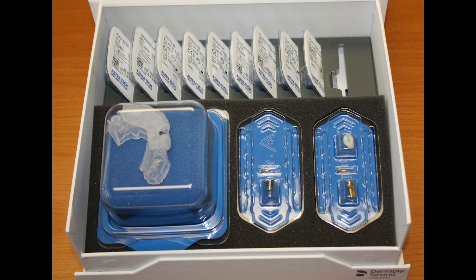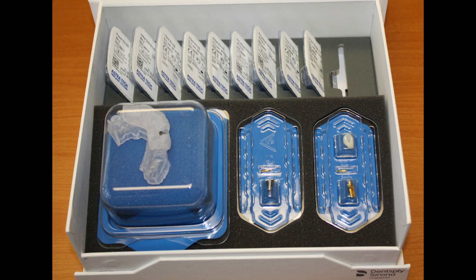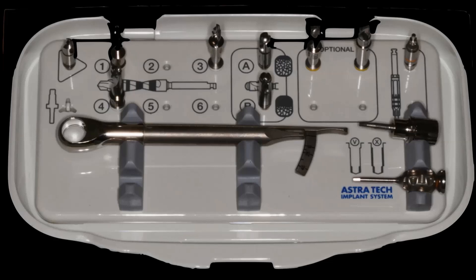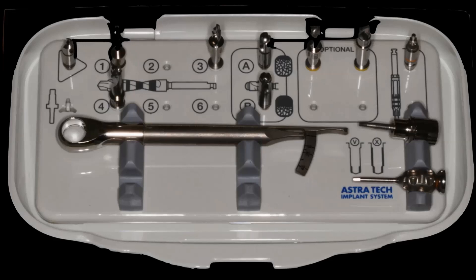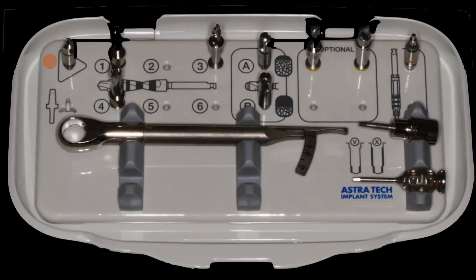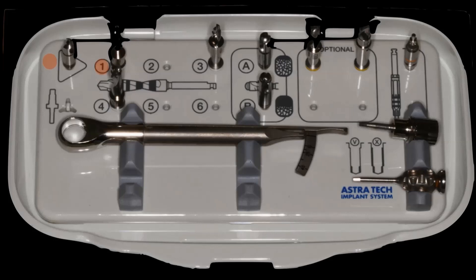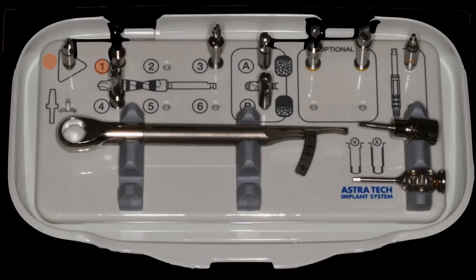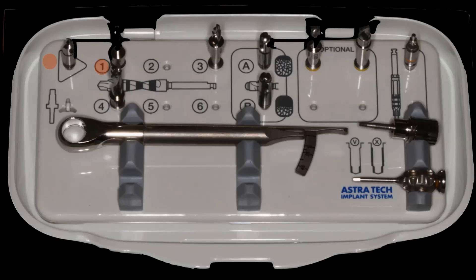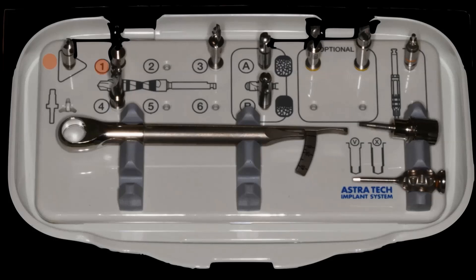What I normally have my staff do right before surgery is remove all of the surgical burrs and place them in the small surgical tray. The Azento kit comes with a recipe that says exactly which drills we need and what order to use them in, so the assistant will simply unpackage each drill and place them in the correct spot within the tray. There is no drill number two for this particular diameter implant, therefore it's not included in the Azento kit, and that makes it a lot easier — with a large surgical kit it's very easy to grab the incorrect drill and use things out of sequence. Here it's impossible to do that because there's nothing sitting in the next spot.